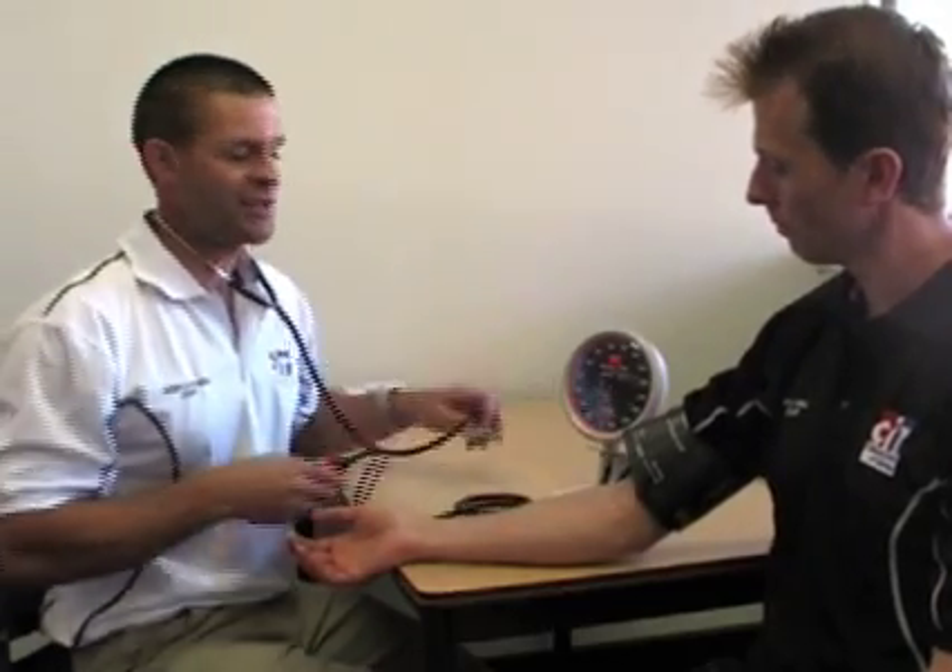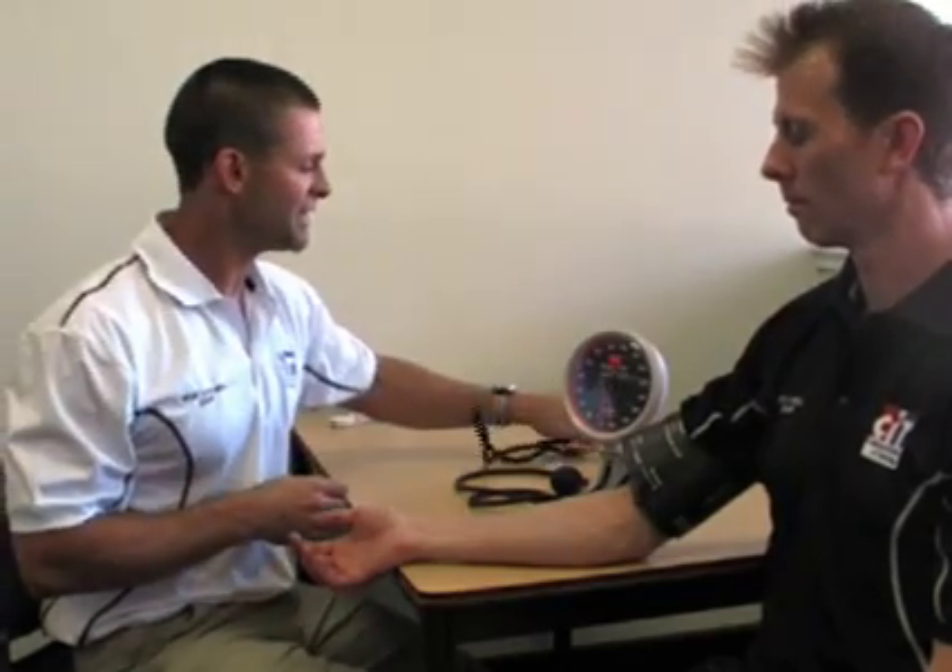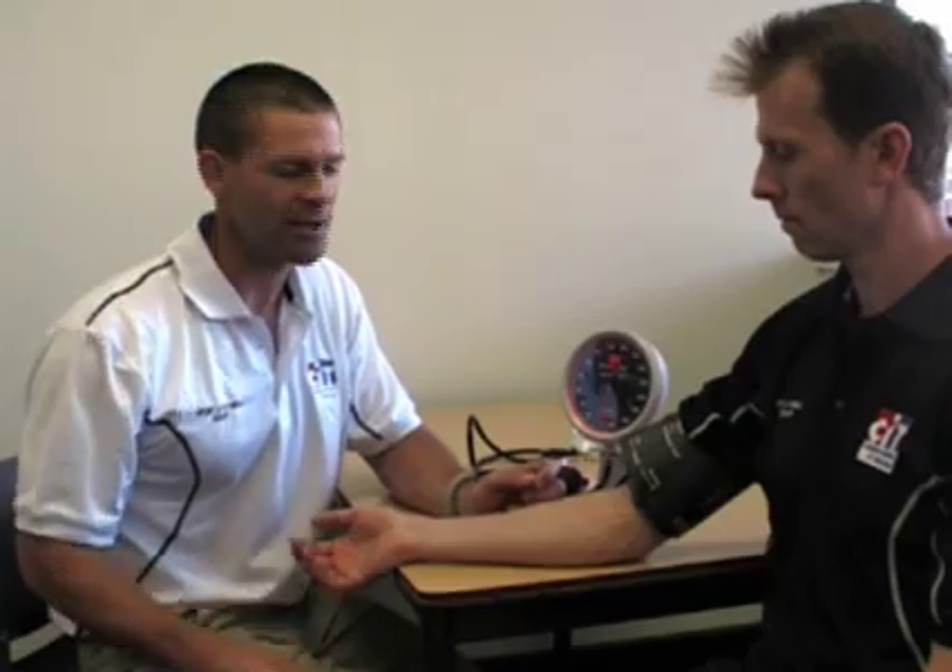There are two types of blood pressure: systolic and diastolic. The systolic blood pressure is the first beat you hear as you release the air out of the sphygmomanometer cuff. As you continue to release the air, you hear a number of beats dropping down, and the last beat you hear is the diastolic blood pressure. That's how you get the standard average blood pressure reading of 120 systolic over 80 diastolic — and that's how we measure it.